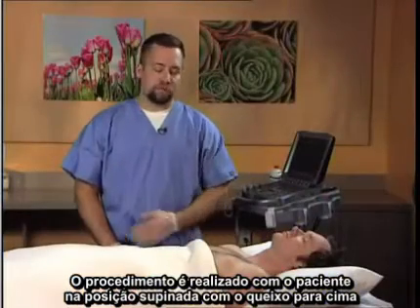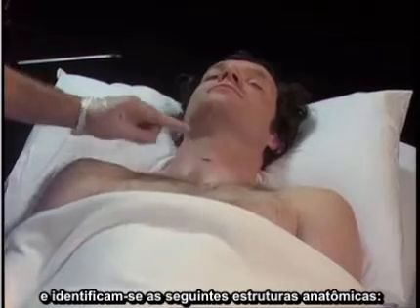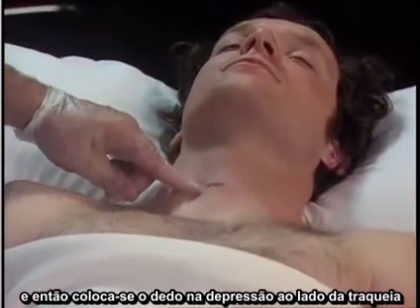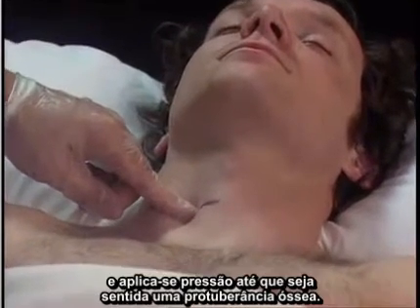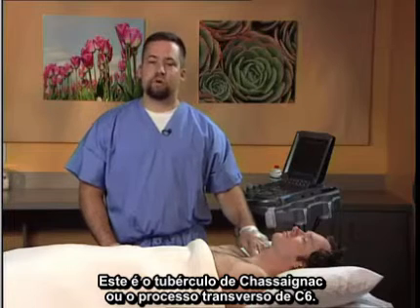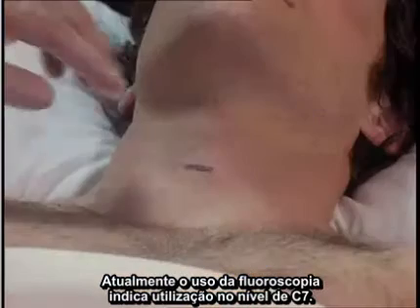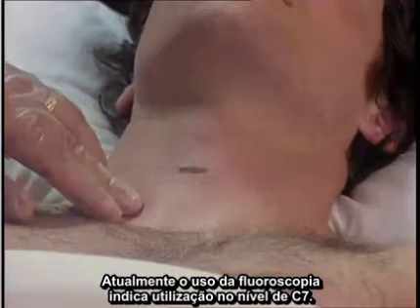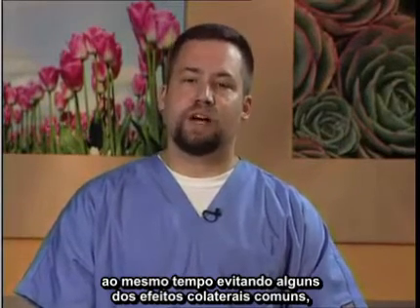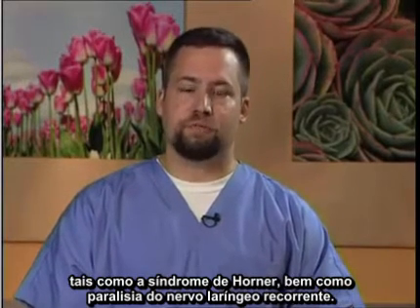The procedure is performed with the patient in the supine position with the chin up. The following anatomic structures are identified: the thyroid cartilage, the cricoid cartilage, and then the finger is placed in the groove next to the trachea and pressure applied until a bony protuberance is felt. This is Chaissaignac's tubercle, or the transverse process of C6. Currently, the use of fluoroscopy indicates use at the C7 level to provide better sympathetic blockade while avoiding common side effects such as Horner syndrome and recurrent laryngeal nerve paralysis.